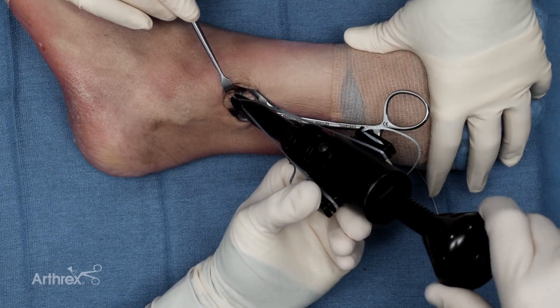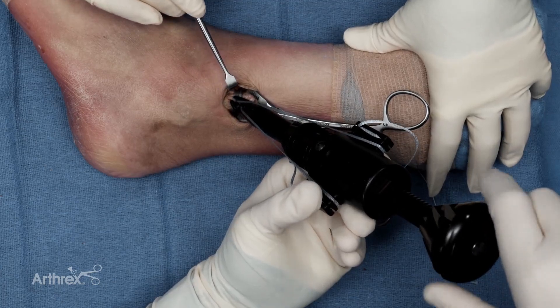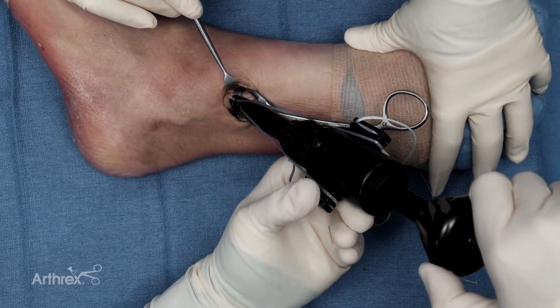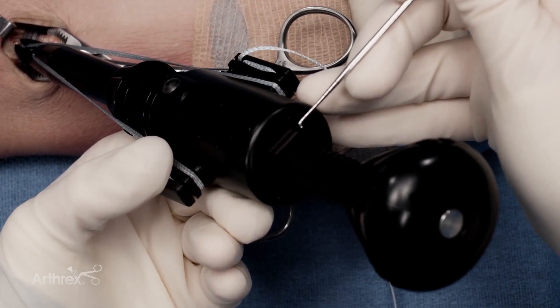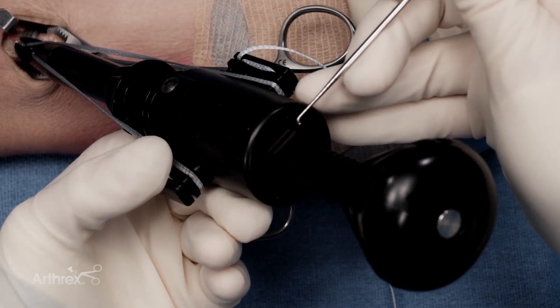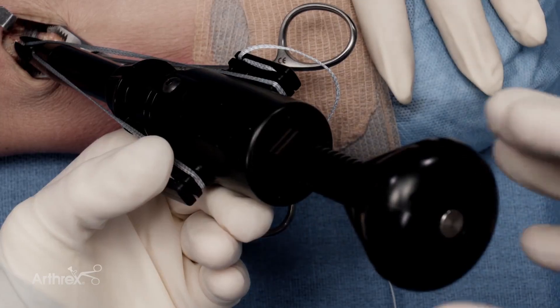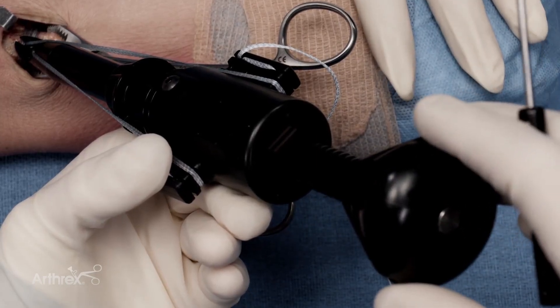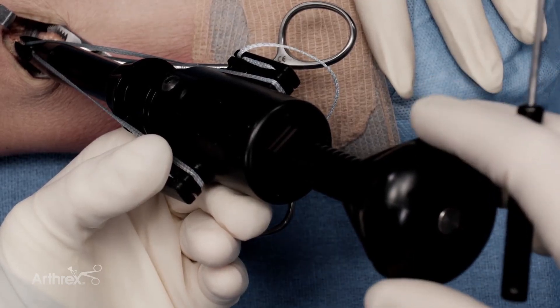Note that despite having a large clamp compressing the fracture, I am gaining additional compression of the fracture site as I tension. You can pay attention to the lines on the backside of the tensioner to know how much tension you have applied — there are four lines and you don't want to go past the fourth line. I feel I have gained a tremendous amount of compression and am satisfied with the maintenance of reduction.